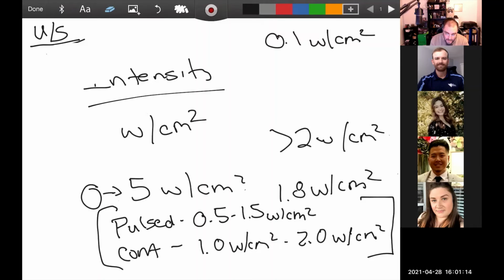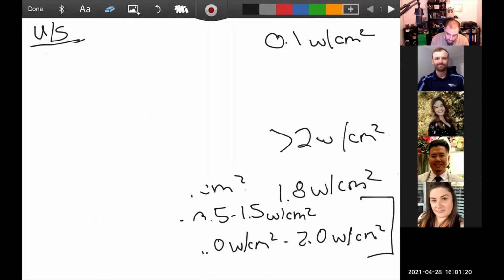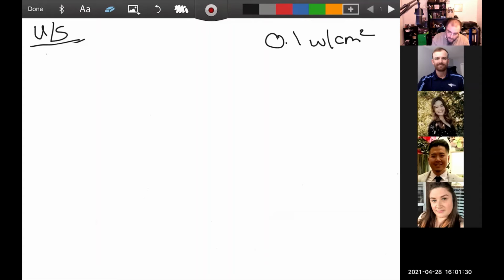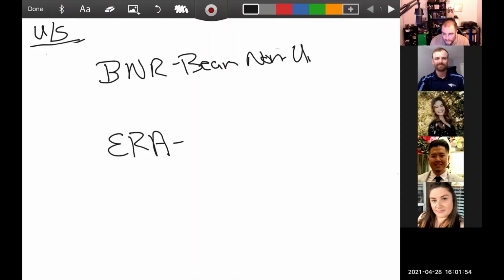The only other thing, and this goes back to, I think Brooke that asked the question about it, was the spreading through the tissue. And with ultrasound, that's going to come down to your ultrasound head, right? And with your ultrasound head, you have two main numbers you watch. You have your BNR and your ERA. And ERA, for those of the guys that are sports people, is not earned run average, right? BNR is beam non-uniformity ratio.